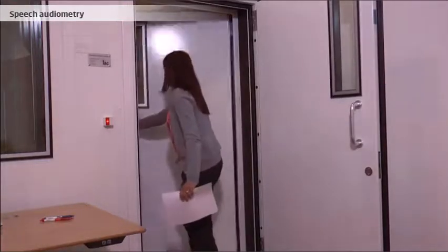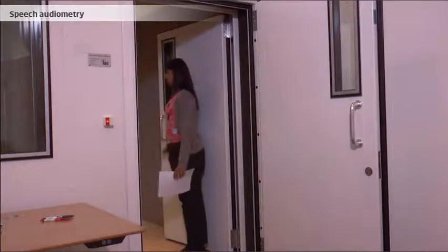For instance, measuring the air pressure and the mobility of the middle ear.